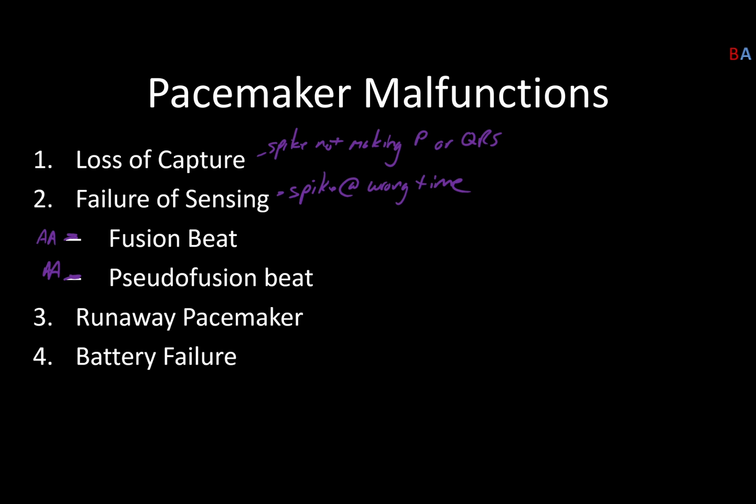Another thing that can happen is what's known as a runaway pacemaker, and essentially you've got too much pacing, and the patient is tachycardic while being paced. And that can get really complicated really quick. I just want to make you aware that runaway pacemaker is a thing that can happen.